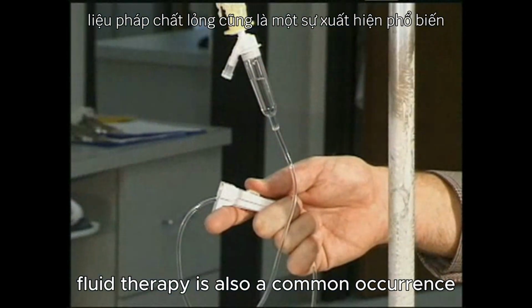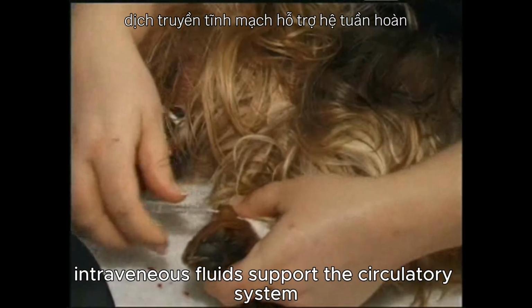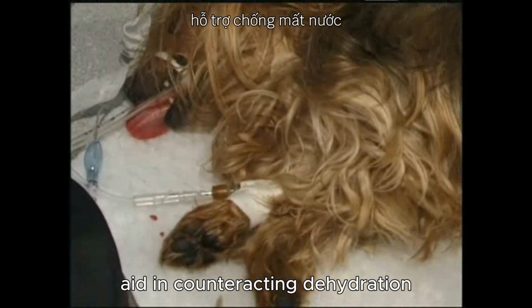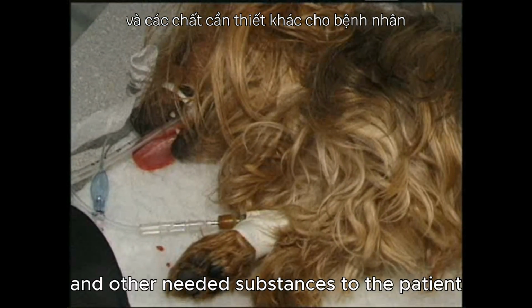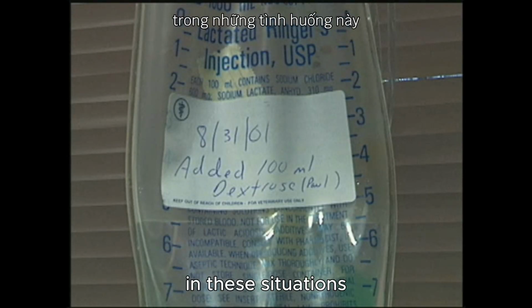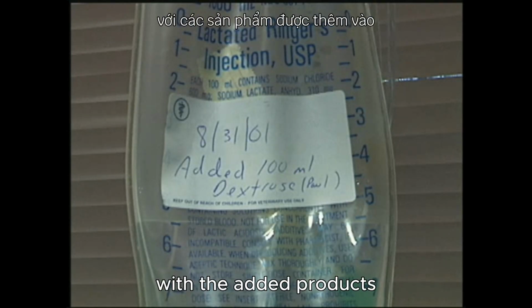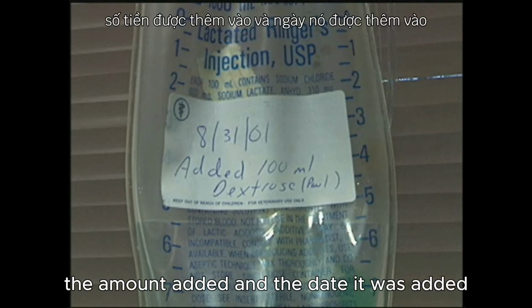Fluid therapy is also a common occurrence in the veterinary hospital. Intravenous fluids support the circulatory system, aid in counteracting dehydration, and provide appropriate electrolytes and other needed substances to the patient. Occasionally, additional solutions and medications may be added to the fluid bag. In these situations, the bag should be accurately identified with the added products. The label should include the name of the drug, the amount added, and the date it was added.